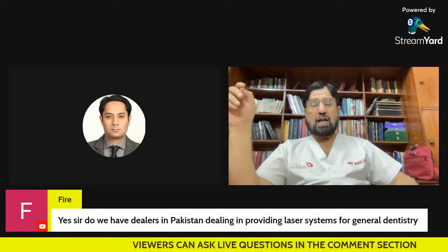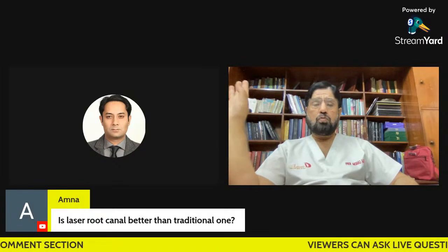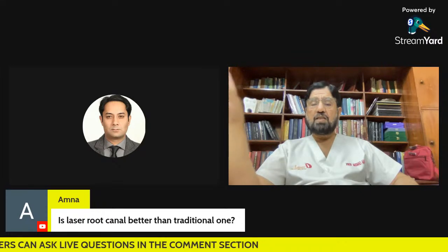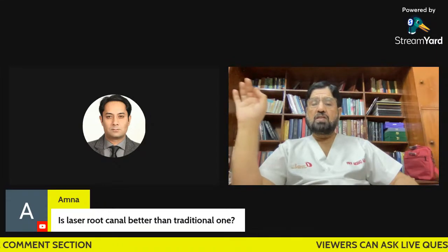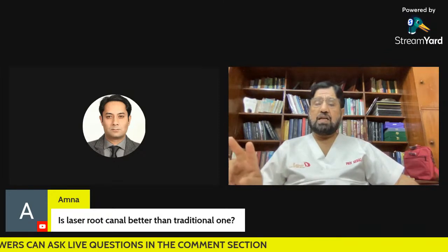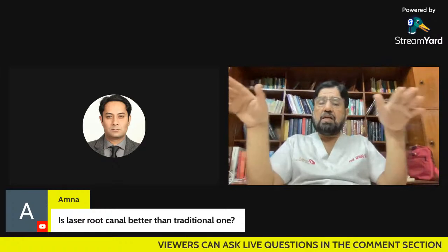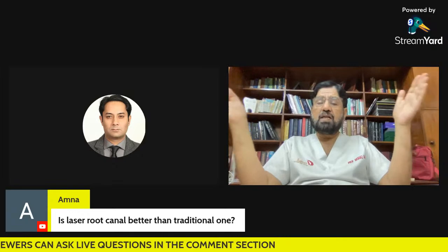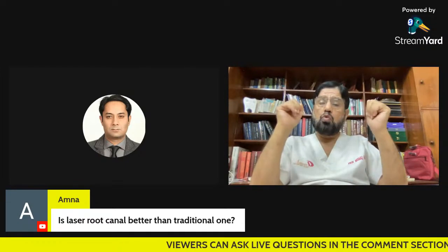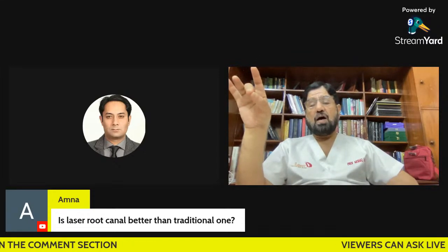Root canal treatment in endodontics has changed its parameters, and laser has absolutely changed the parameters. The time is coming when there will be no conventional endodontics, and it will be wholly replaced by the laser. The laser endoprobe, when we insert it into the endodontic canal, melts the dentine. It gives two effects at a time. One, it sterilizes the canal at once. Number two, it melts the dentine of the periphery, and that melted dentine comes into the dentinal canal. The pulp canal in the root is filled by its own dentine. So no obturation material, no repeated dressing, nothing for the endodontics.